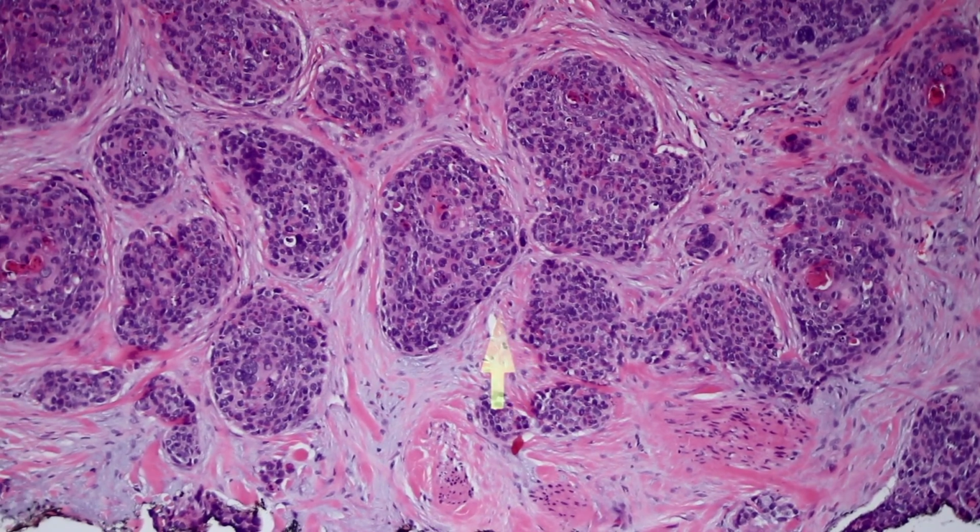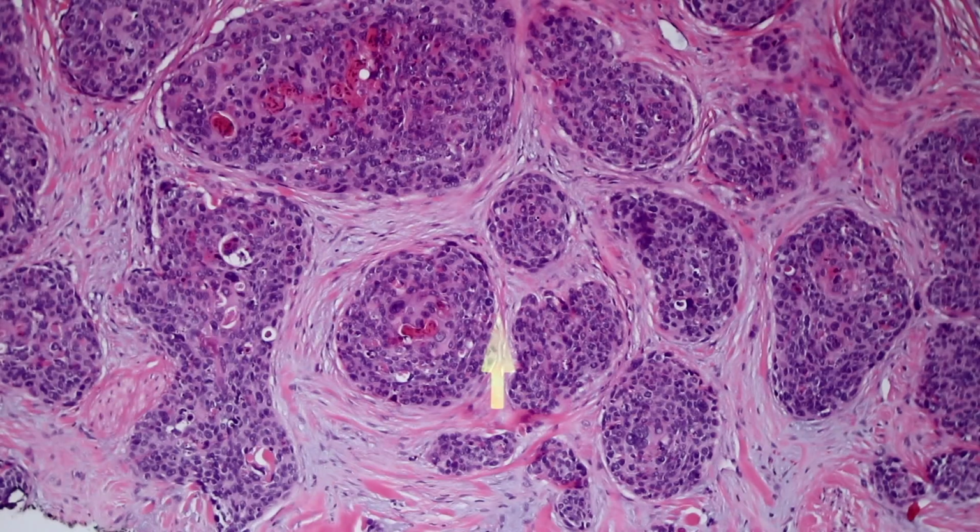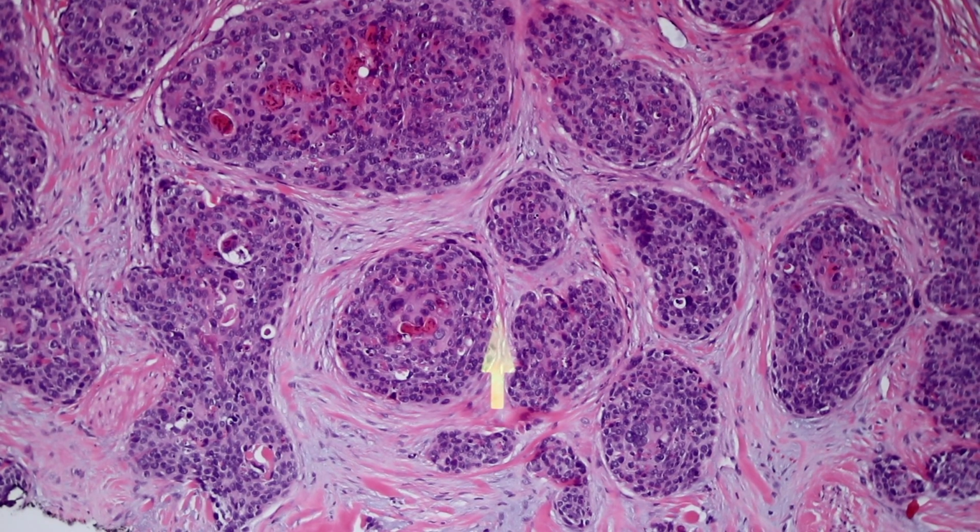Okay, and this one's kind of bluer than usual, and I'm going to again show you a lot of different examples of squame in this video. Some squames are very pink and glassy and obviously keratinocyte. Some of them look darker blue like this, and those you might wonder, oh, could this be basal cell carcinoma?